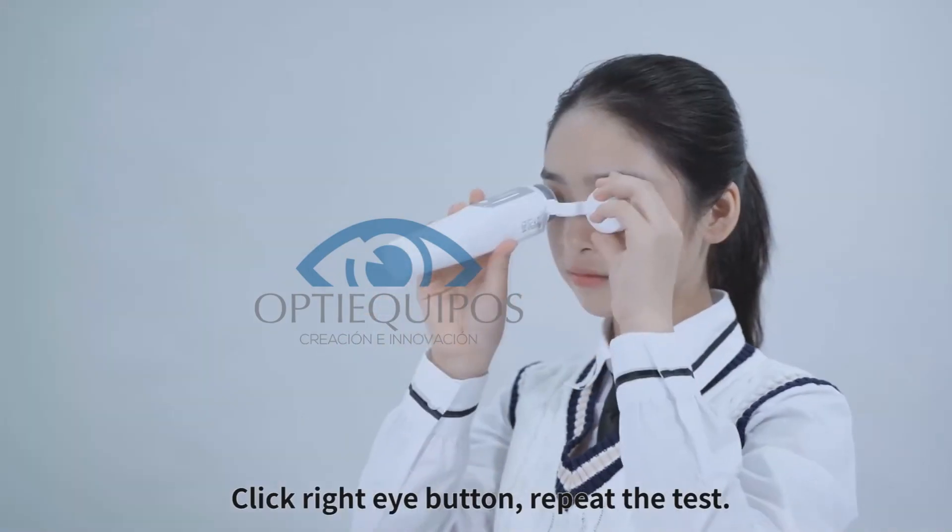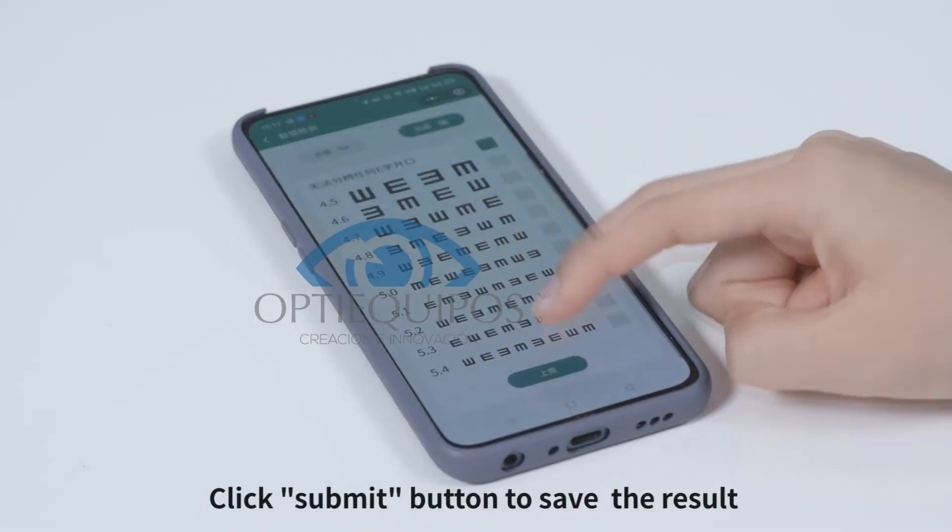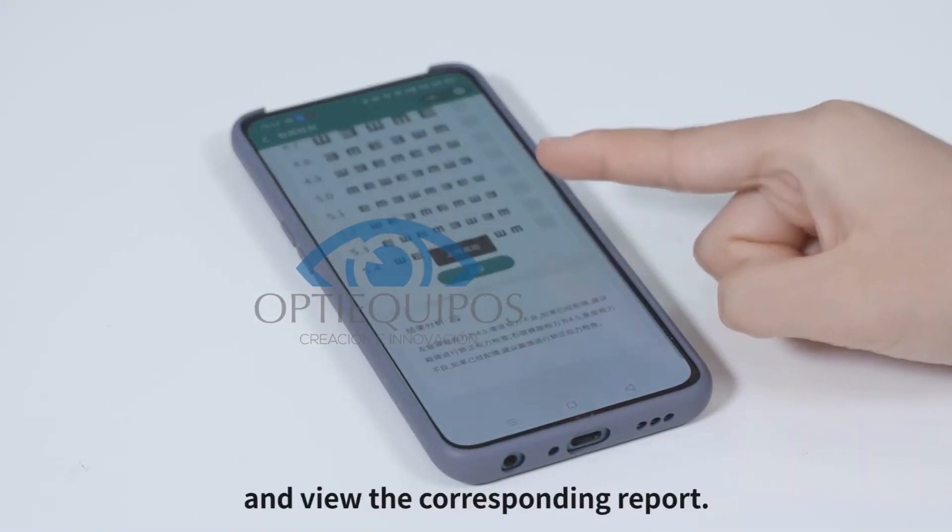Click the right eye button and repeat the test. Then click the Submit button to save the result and view the corresponding report.